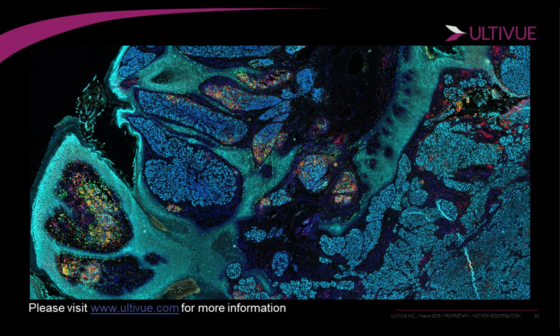When you're doing a multiplexed assay specifically, say you're doing 3 or 4 markers, for example, you're doing amplification of each one of your tyramides at a different position and at a different time. They also happen at a different rate, because as you can imagine, if you're using a rabbit and then a mouse primary antibody in each one of your rounds, you're using different secondary antibodies to do that detection and amplification. And when you're using an amplification methodology that's not linear, you tend to run towards saturation, and it makes it very difficult to compare.